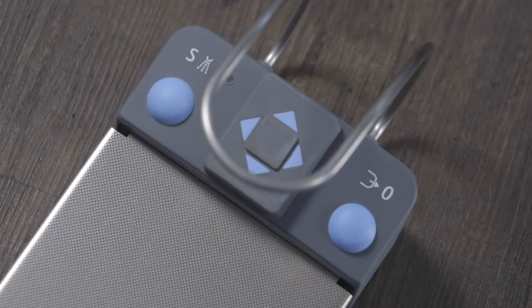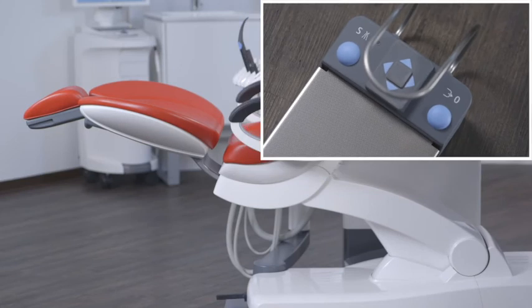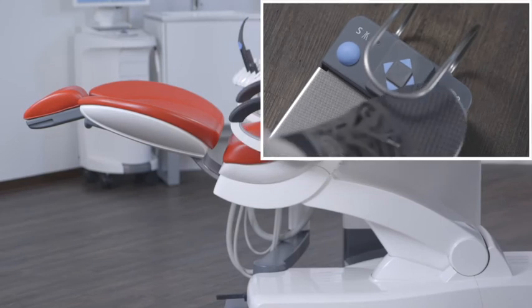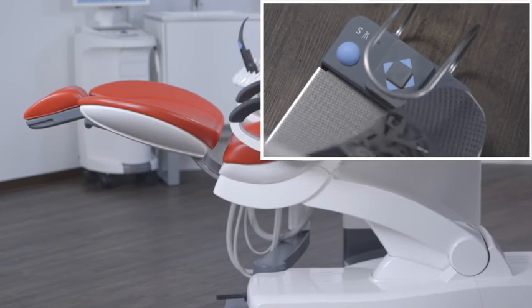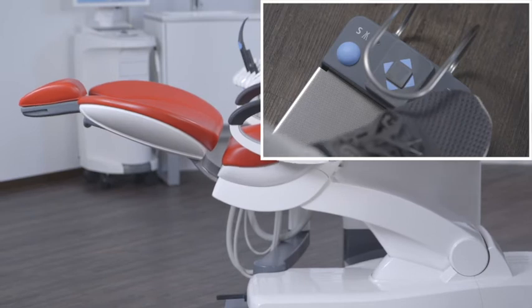When all instruments are deposited and the right button is pressed, the chair is moved to the entry-exit position 0.